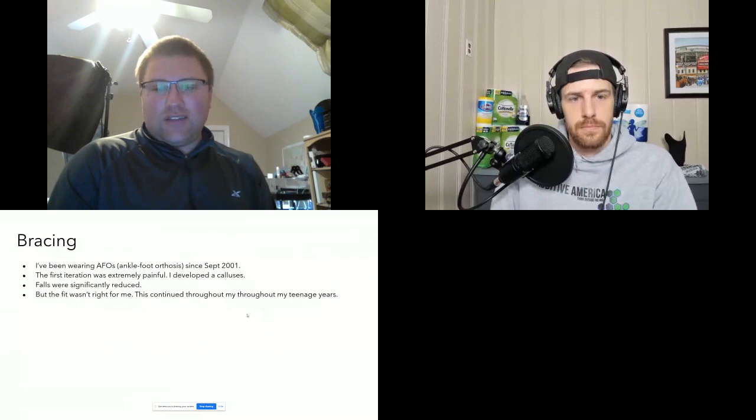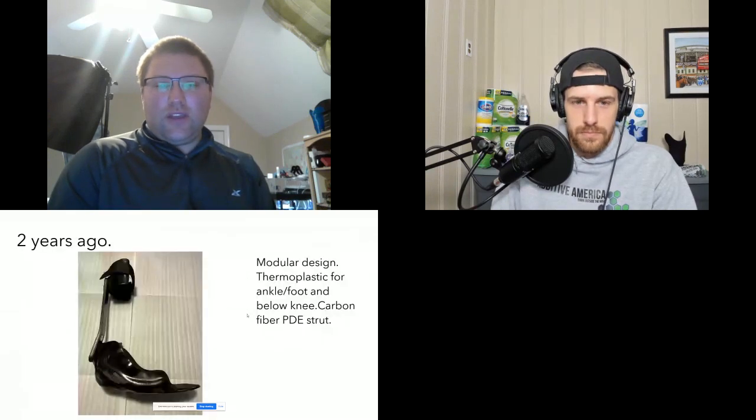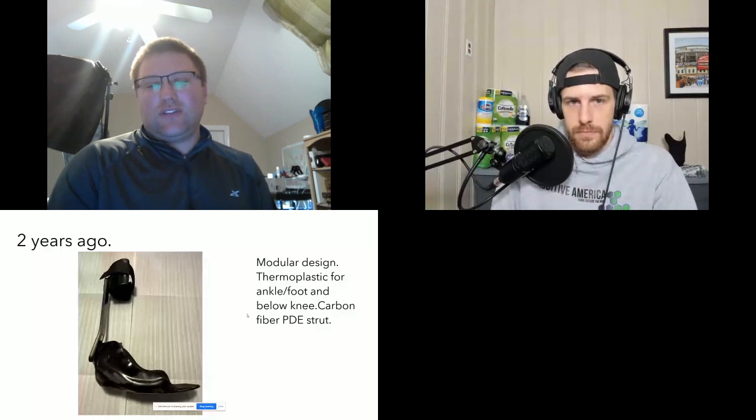But we wanted to try something with 3D printing. And so at first we had tried something with PETG, and that was just a complete disaster. And this was three or so years ago. And then about 2 years ago, we went to a style that has a composite strut, carbon fiber strut in it. And it actually worked really, really well. And the neat thing about that one is that you can change the stiffness of the strut by changing the struts out. So it was definitely a modular design.